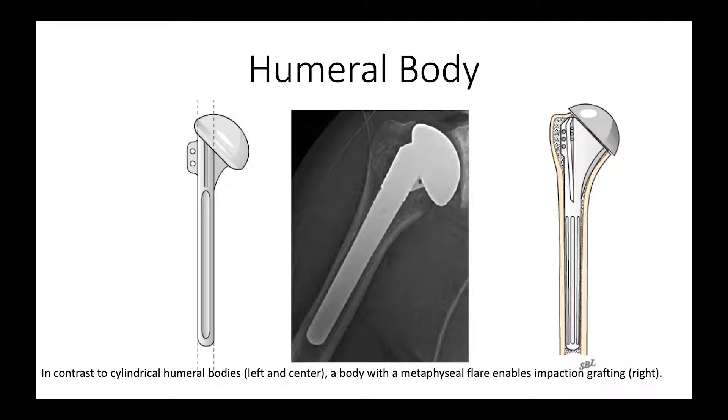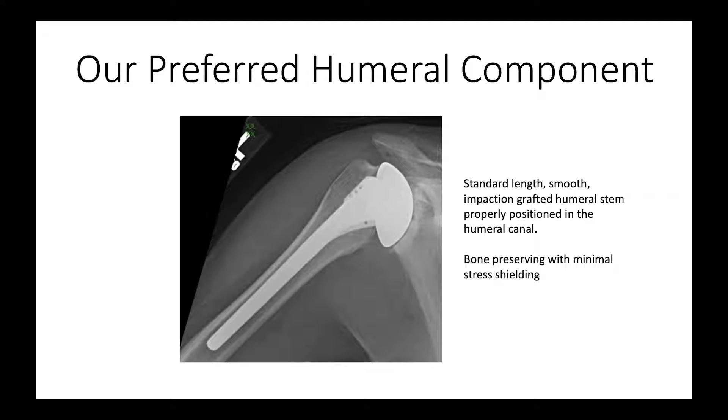Some bodies are cylindrical, like this one here and this one here, but these are very difficult to fix using impaction grafting, which is our favorite technique for securing the humeral stem in the humeral medullary canal. So this is our preferred humeral component and our preferred method of fixation. This is just a simple standard smooth stem — it's not too tight distally, so we can seat it all the way. It is properly positioned within the canal, and we have preserved a lot of the bone stock, because the only part of the bone that was removed was the arthritic humeral head, with bone graft harvested from the resected humeral head.